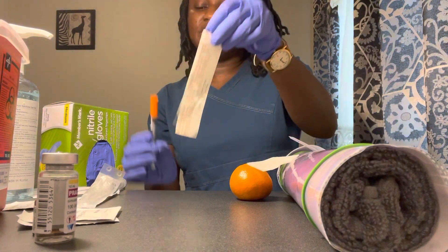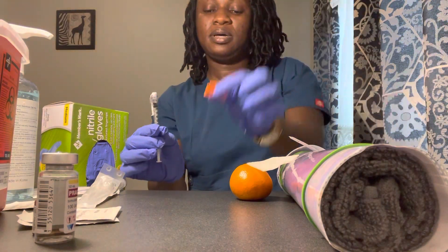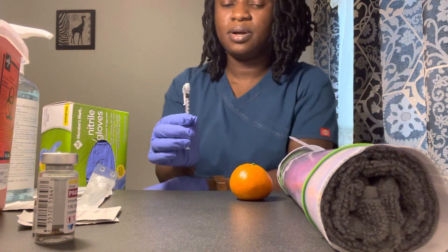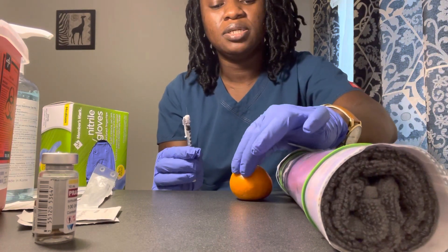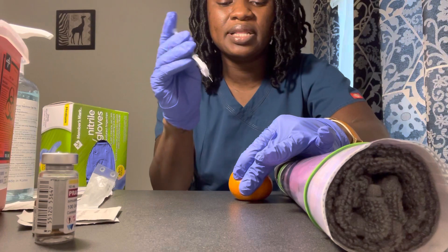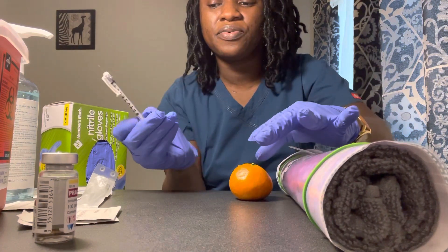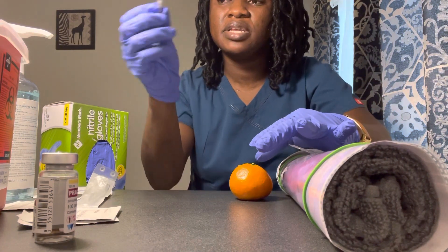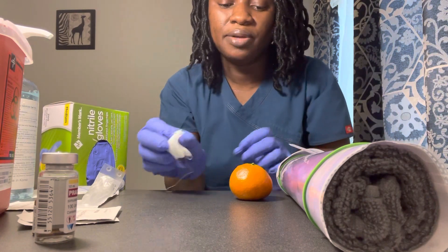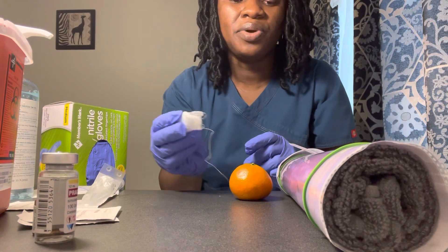When I administer this injection, the needle will go in the sharps. You're going to feel a pinch. I'm going to pinch the skin and go at a 45 to 90 degree angle. You're going to feel a pinch — medication coming in. Okay, you did great. Go ahead and activate the safety needle and it goes into sharps.